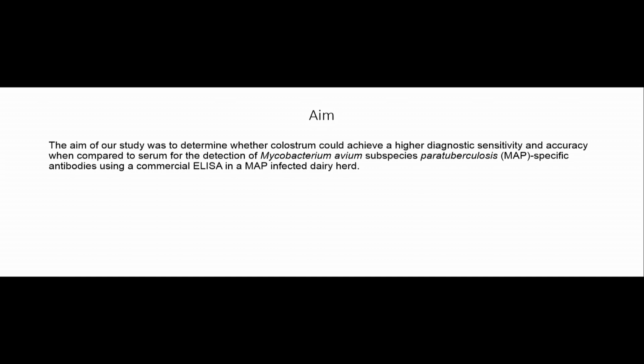So that's our aim. We were interested in looking at the performance parameters of colostrum as opposed to serum using a MAP ELISA test.